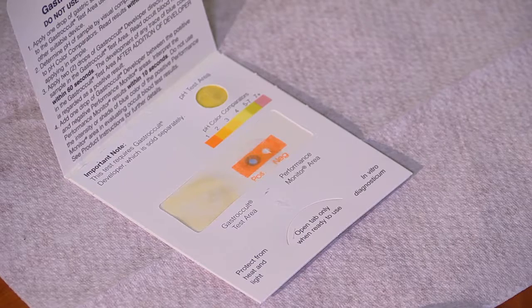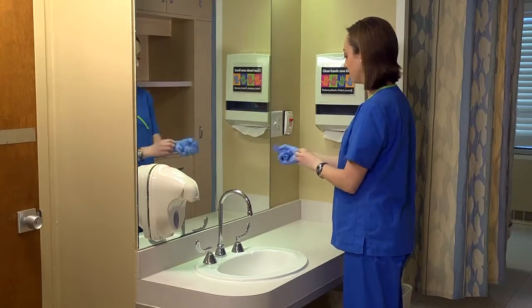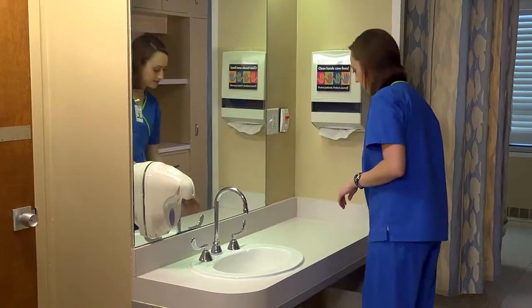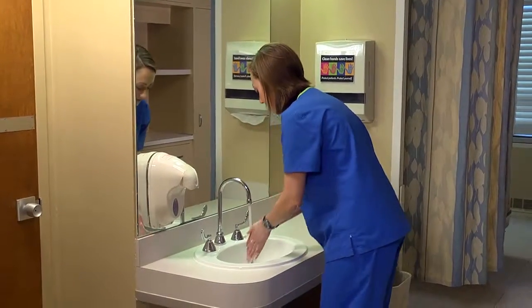Dispose of the test slide and the wooden applicator or syringe. Remove your gloves and perform hand hygiene. If the test is positive, report the results to the healthcare provider. As part of your follow-up care, continue to monitor the patient.